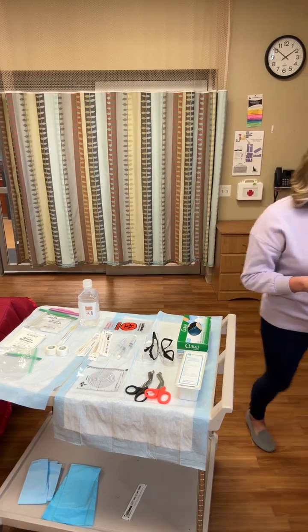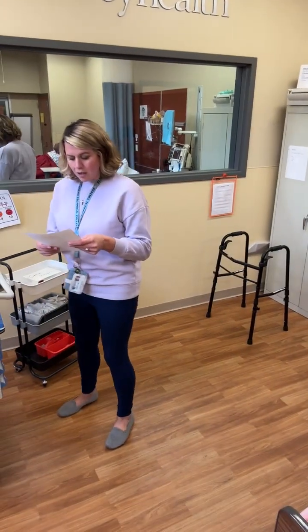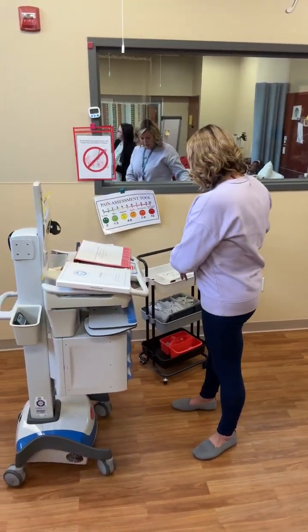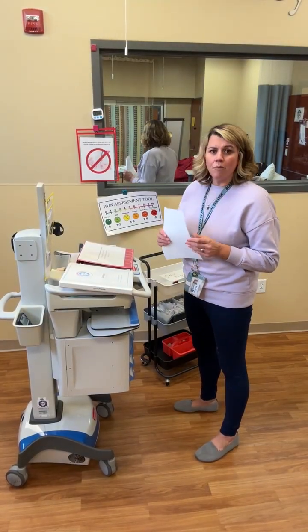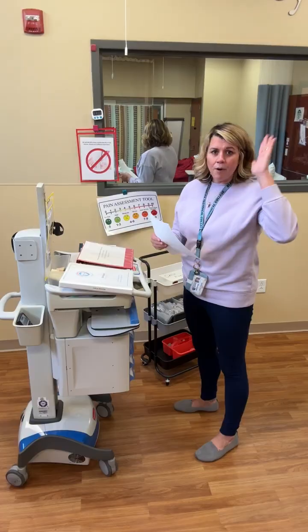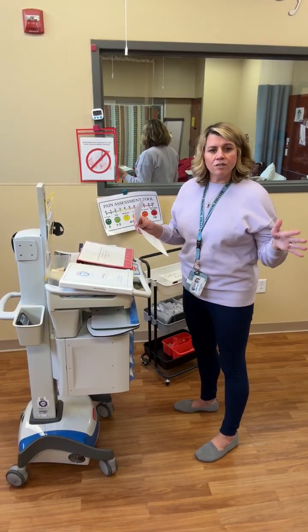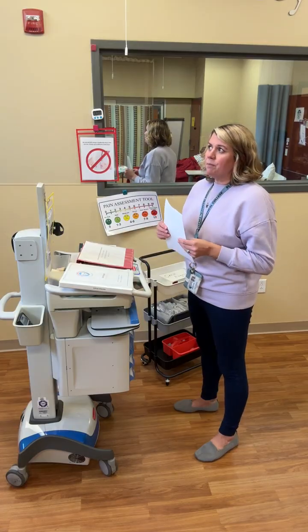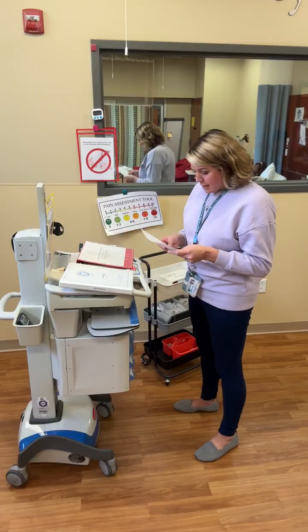Next thing we're going to talk about is med checks. So when we come over here, this is generally the location of where the workstation is going to be and the med box. When you are ready to do your med checks, you're going to say, "Pause sim, I would like to do my med checks." That means everybody else in the room is going to be quiet so that we can hear you and that you have a clear time to review all your meds so you don't make any mistakes.